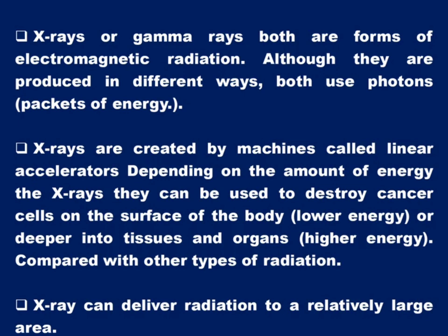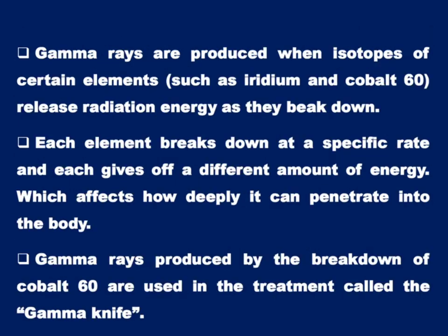If we want deep penetrating, like the 20 MV shown here, it has a more forward direction and is more focused, rather than the weak intensity radiation, which is more scattering and unnecessarily produces radiation reaction. So typically we should know about the X-ray mode of a linear accelerator and the electron mode of a linear accelerator head.